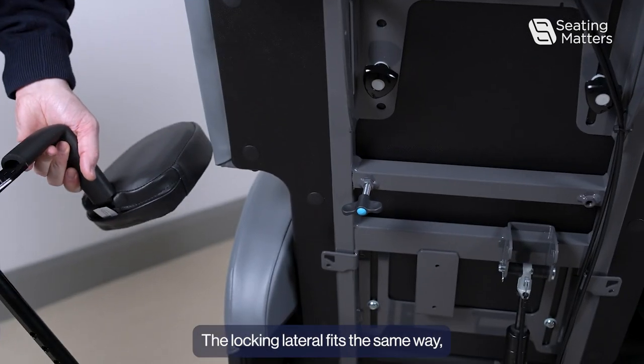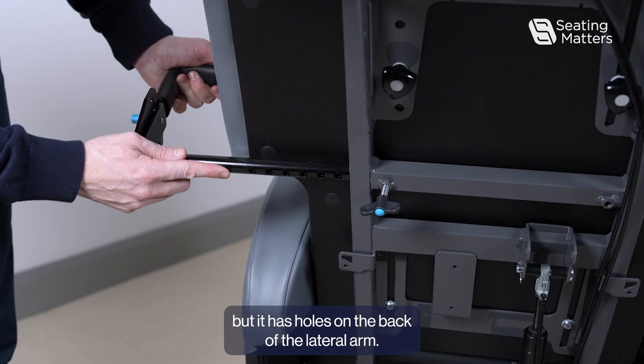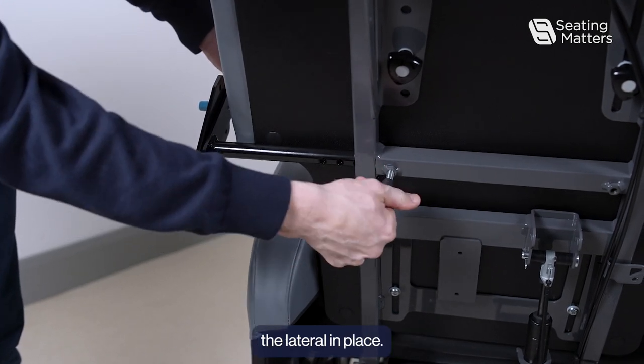The locking lateral fits the same way, but it has holes on the back of the lateral arm that allow you to further secure the lateral in place.